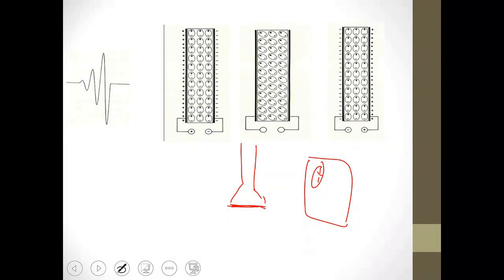In the crystal, there is something called dipoles. Each dipole has a part with a negative charge and a part with a positive charge, like one end having a positive charge and the other end having a negative charge. Now, if you raise the temperature above a certain limit, known as the Curie temperature for this crystal, it starts to lose its orientation inside, as if these molecules have begun to move freely.